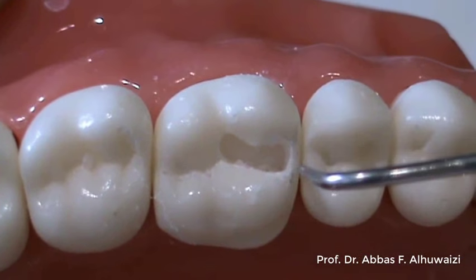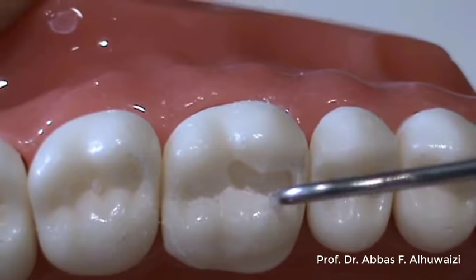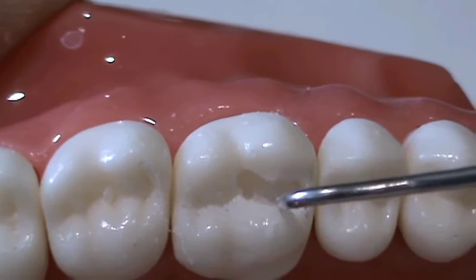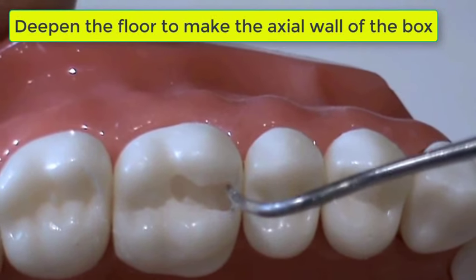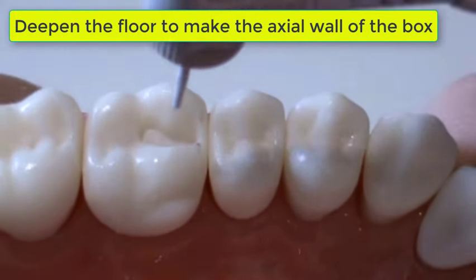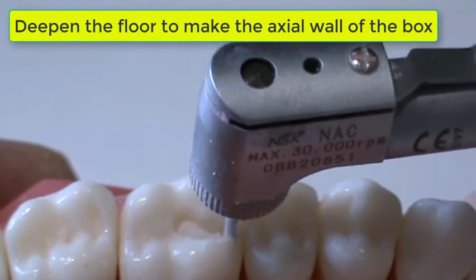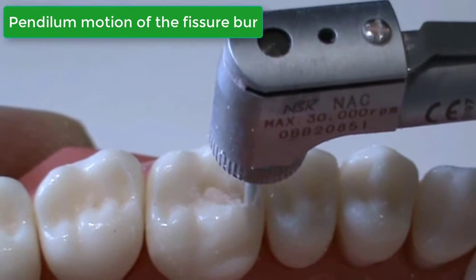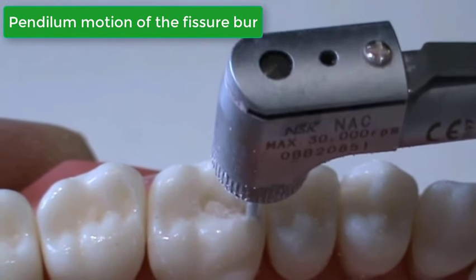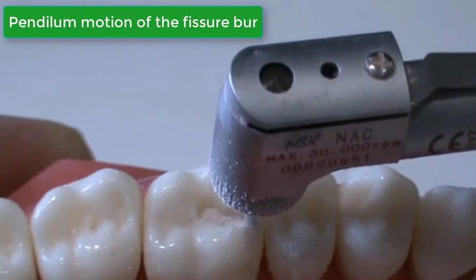The depth of the cavity should remain the same as with the Class 1 cavity. Step 2 — making the depth of the box: place the Fissure Burr at the mesial marginal ridge and push the handpiece downwards to create the axial wall. Notice the pendulum action of the handpiece.